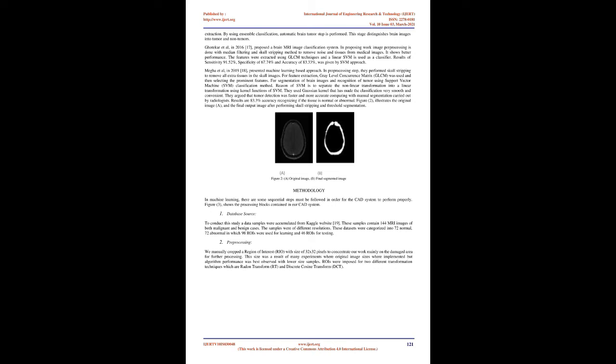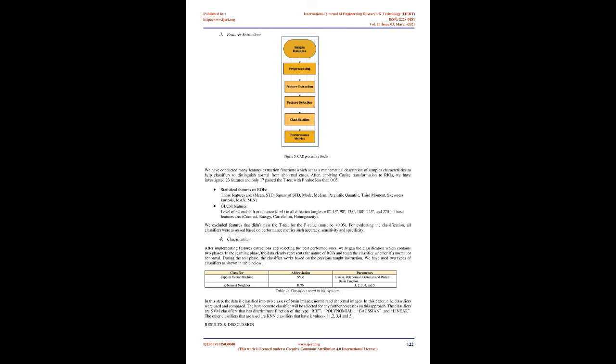Step 2. Image segmentation using fuzzy C-means, FCM, to separate the different normal brain tissues. In step 3, feature extraction using discrete wavelet transform, DWT, and using the principal component analysis, PCA, method to estimate the original extracted features with reduced dimensional feature vectors. Last step is classification using a deep neural network, DNN, classifier.